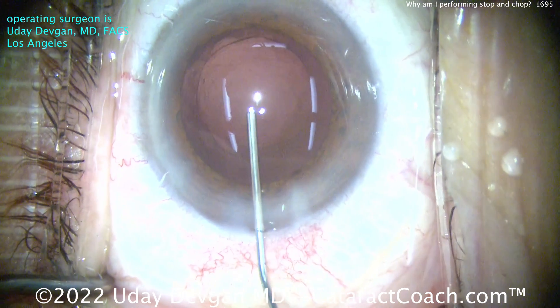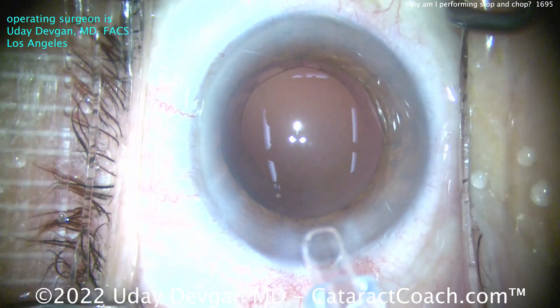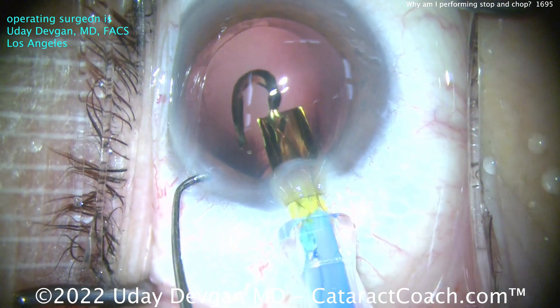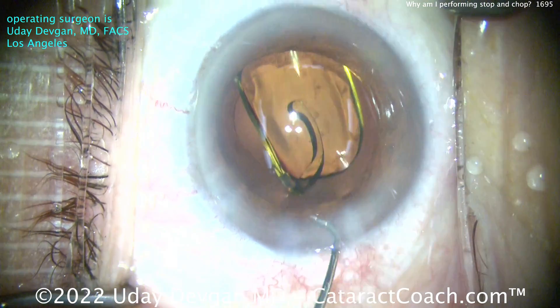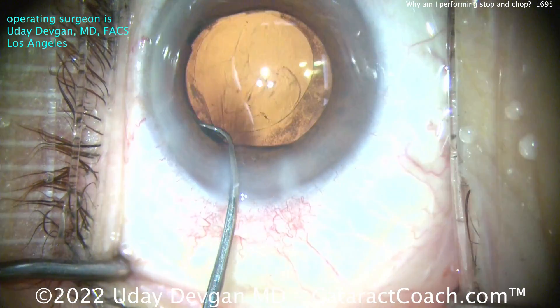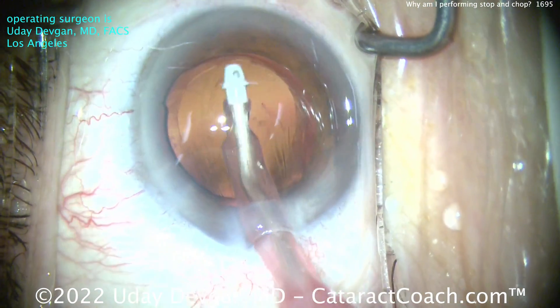I want you to take that same pride in your work as well. Filling up our capsular bag, we'll polish up that anterior capsular rim a little bit more. Let's get that big lens in the eye first. There's the cohesive viscoelastic to fill up that capsular bag. We're going to bring our lens over — it's one of these preloaded lenses. It's going to be a little bit of a tight fit because it's a higher diopteric power. We won't be able to get the tip fully in the eye; we'll just abut the incision and deliver that inside the eye. For these preloaded lenses in higher power like this 29-diopter, they come with a slightly larger tip, so I had to do that wound assist technique.